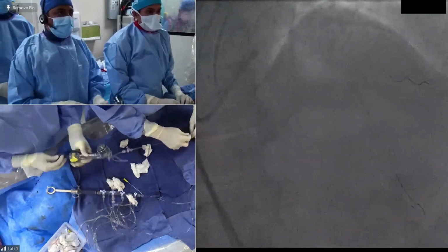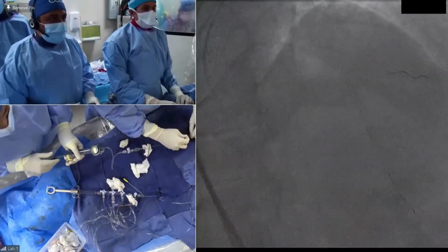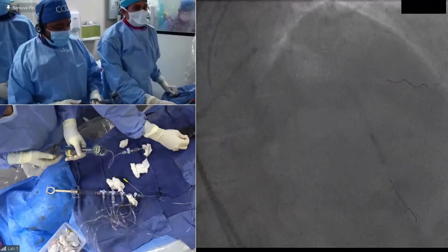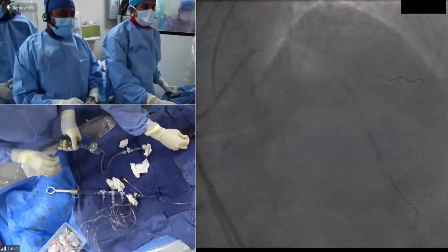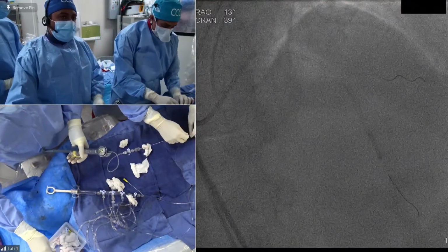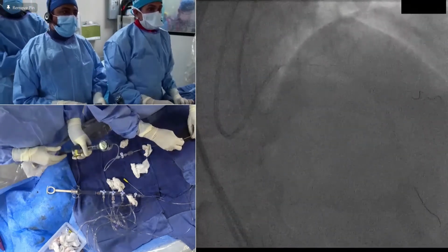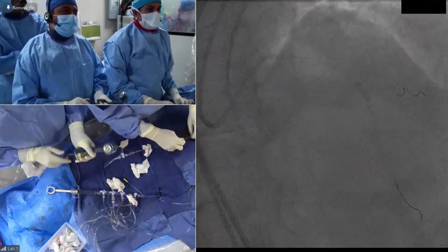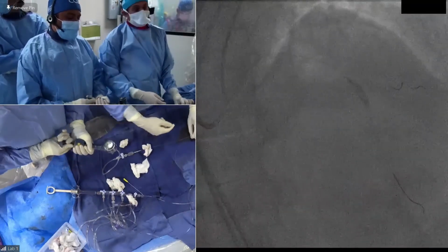Okay, go here, 4 atmospheres. Let's do a little gentle massage at the bottom. Be a little careful. Yeah, I think let's finish it. Short massage. Yes, only 2 atmospheres. Yes, 4 atmospheres. Out, down. Good, down. We call it a little psychotherapy there. And then we go high pressure at the proximal edge here. Yeah, that's right. Good. Yeah, 18, 20. Yeah, good. Great.